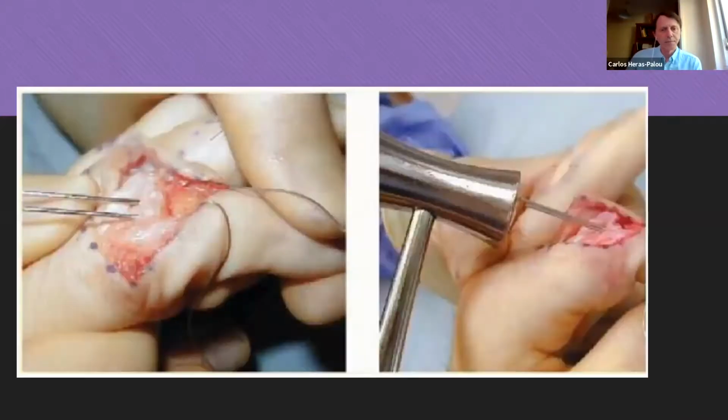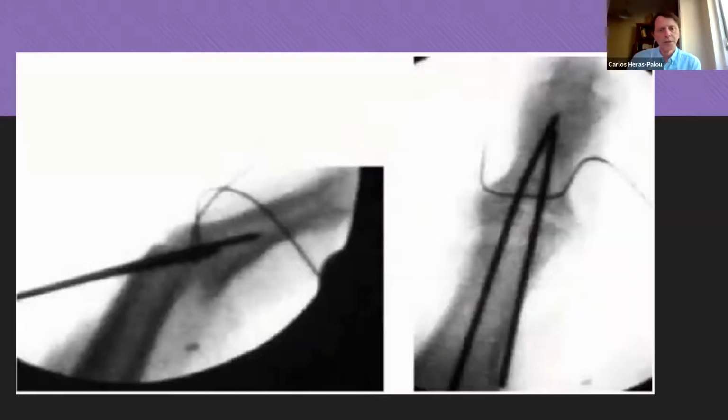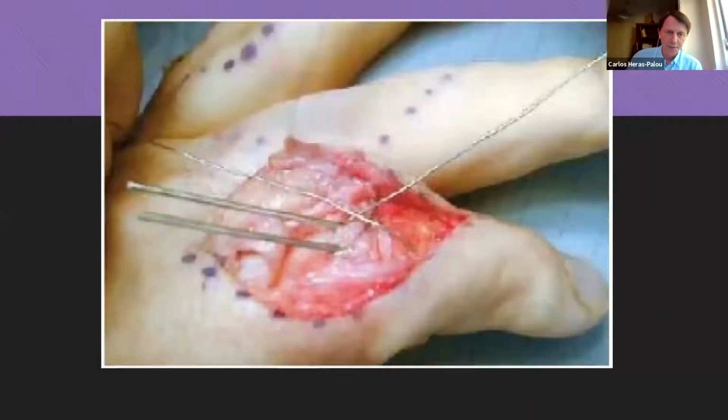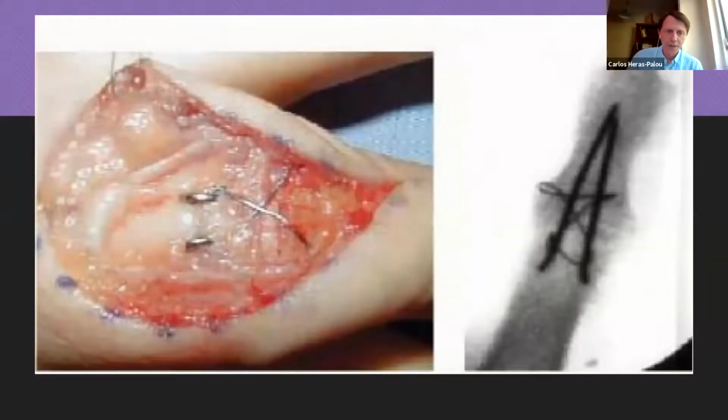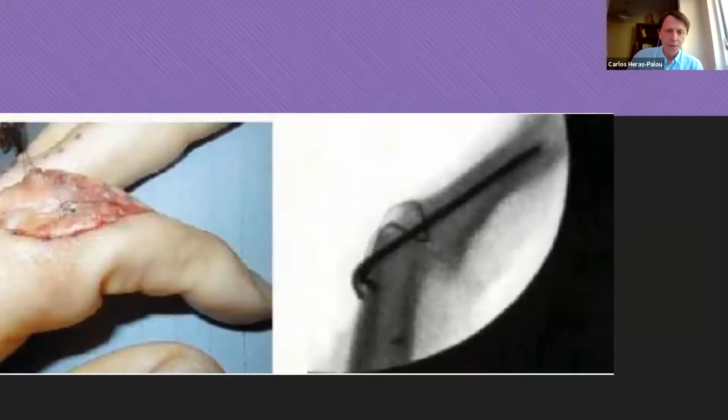2K wires parallel, push them in. Can you see how those wires look like they're bending a bit? That's because we just push them in, ease them in gently, rather than, if you had put that in at high speed with the drill, you'd have gone through the cortex. And then you do a figure of eight, tighten it up, bend the wires up, cut them, turn them. And that's how it should look. If you run your finger over that, it should feel really nice and smooth. And then just close it up.